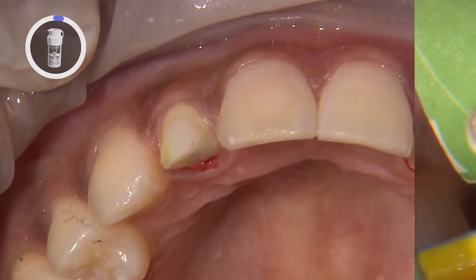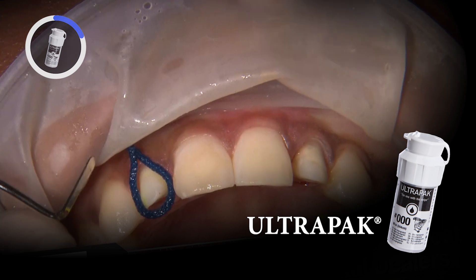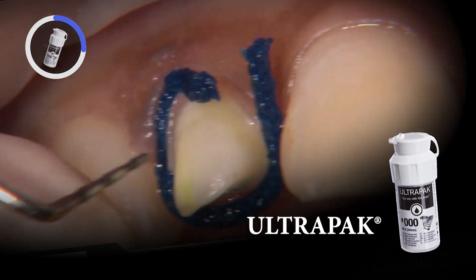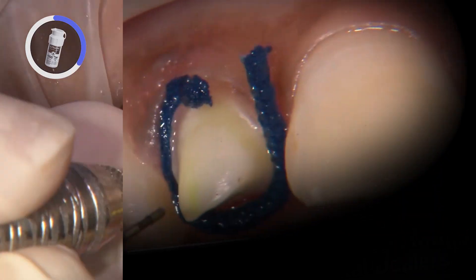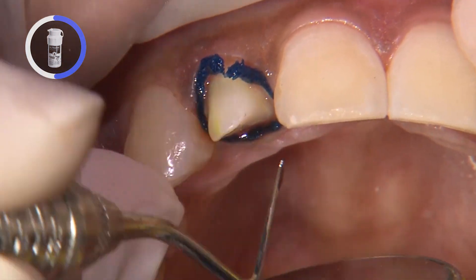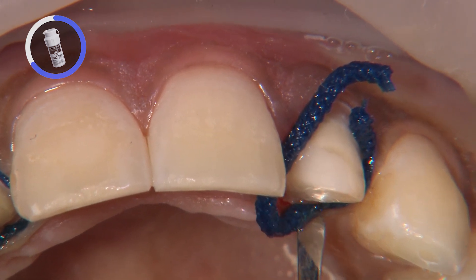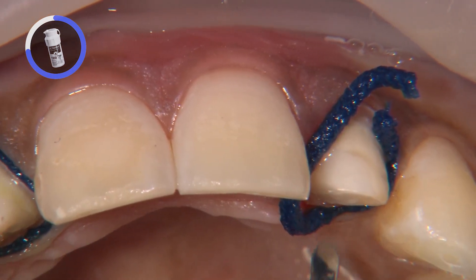Since the margins are slightly subgingival, I use a size 1 cord to help retract the tissue for the impression. In tight spaces, I use both a perioprobe and a serrated cord packer to place the cord just below the margins. After five minutes, I remove the cords and dry the preps and sulcus really well for the digital impression.